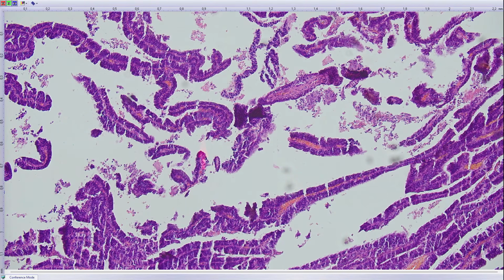So it is imperative to make HPV testing and not do P16. P16 is positive in both of these lesions. Only HPV genetic testing distinguishes these two lesions.